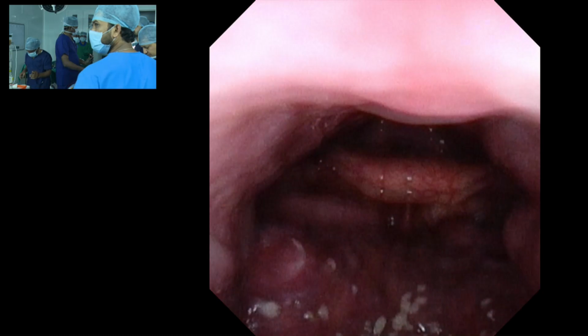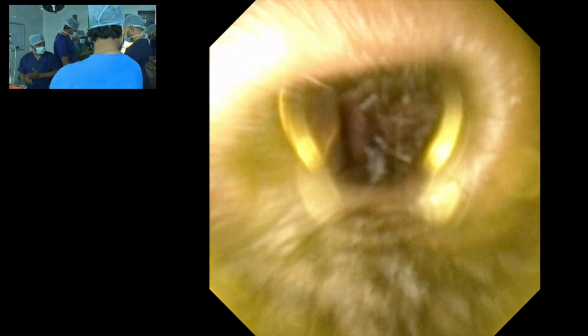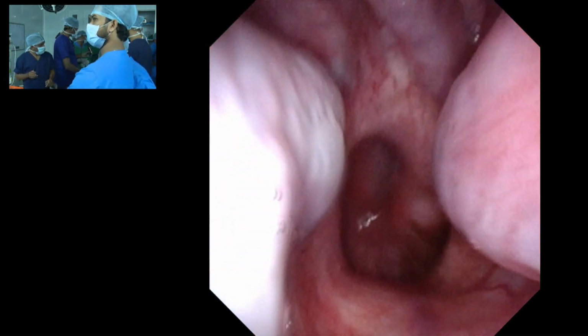So the vallecula is partly being covered by the tongue base, isn't it? Yes. Minimal lingual tonsil, maybe grade 1, I would say. See, these things can happen when you don't anesthetize the throat or oropharynx. And usually these patients have a lot of laryngopharyngeal reflux and they will be very sensitive. If you see the tongue base, there are some white spots, and many a time that could be because of the LPR itself. Yes, or query fungus.